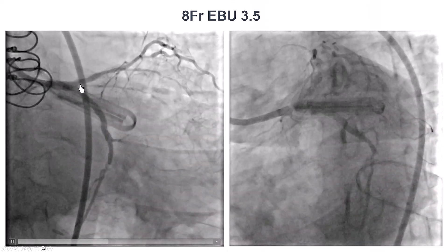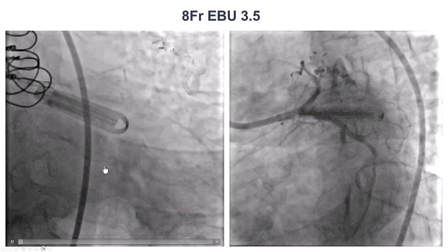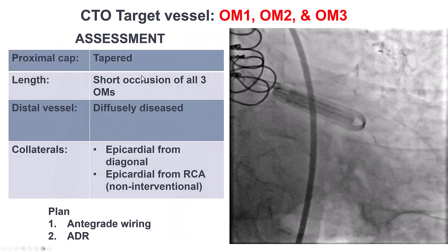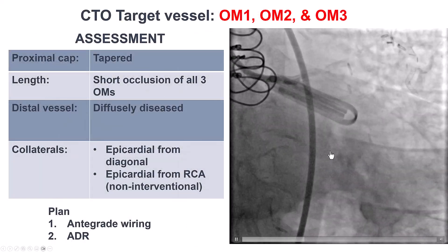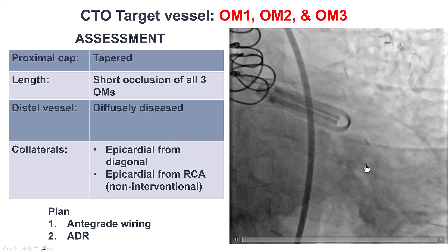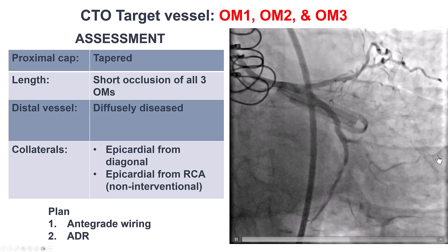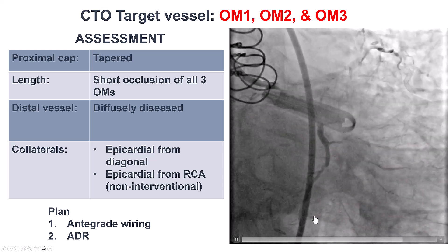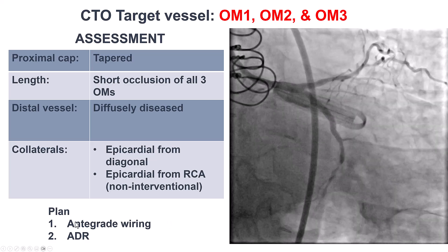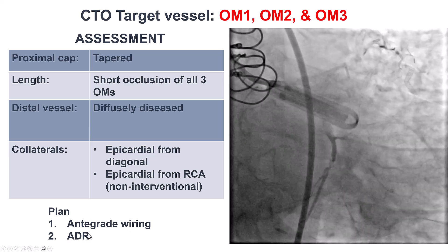We then obtained another guide catheter and engaged the left main, revealing the CTO in the obtuse marginal and another CTO in a second obtuse marginal. The first one appeared favorable with a nice tapered entry and a decent-sized distal vessel. The collaterals did not seem adequate for going retrograde, so we decided to pursue antegrade wiring and antegrade dissection re-entry without a retrograde approach.